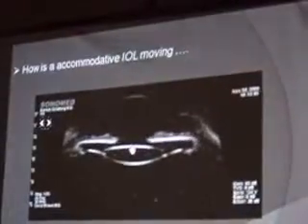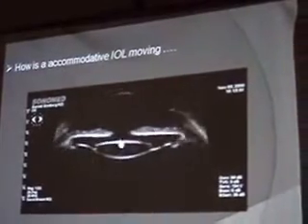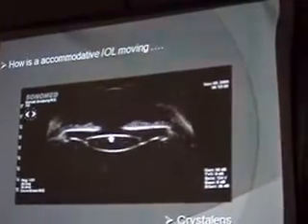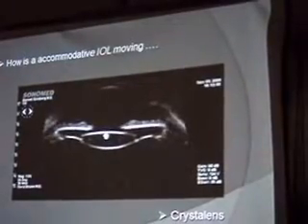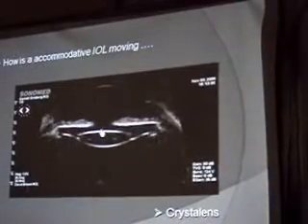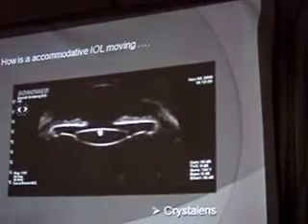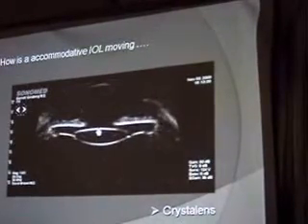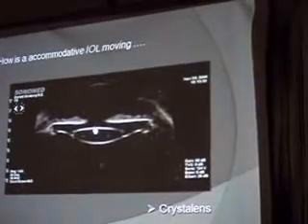It's the whole anterior uvea pushing forward. Means that the whole ciliary body moving forward forces the lens to remain down where it is, where it has been originally placed. Which means that the effect of accommodation that this lens has may need a different explanation than the one that has been provided.